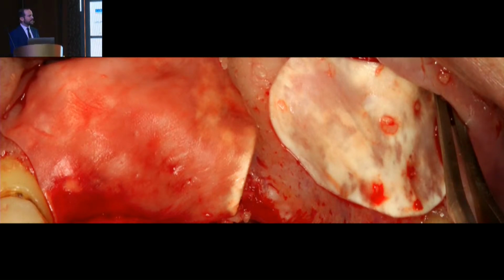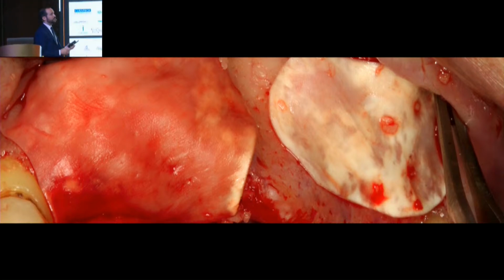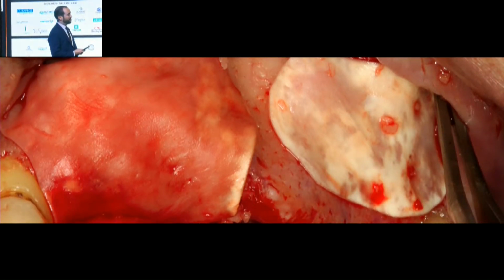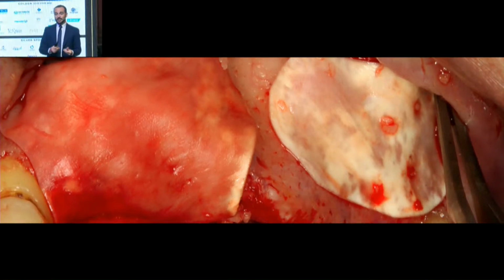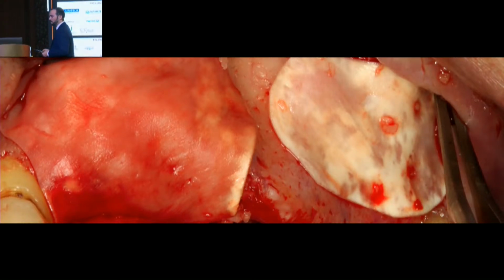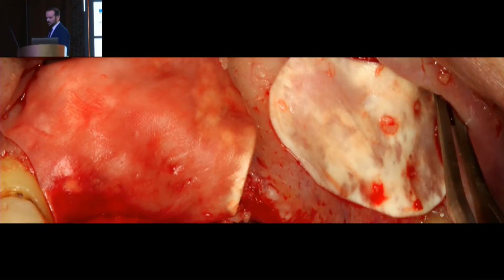I believe somebody else was saying yesterday or the day before that there is actually no need for covering the maxillary window when we access. That is absolutely true. There is no need, and when we look at the evidence as far as results, and so on, there seems to be no difference. Me particularly, I always like to cover the lateral window when we access the maxillary sinus because it's not only about mineralized tissue, it's also about prevention of the bone grafting from coming out of the maxillary sinus.